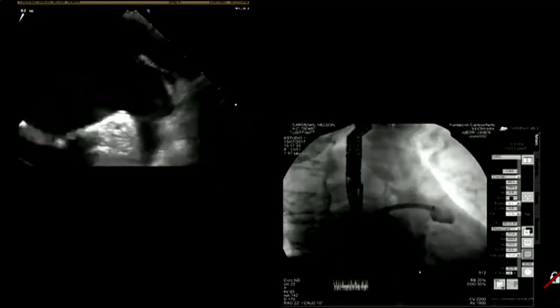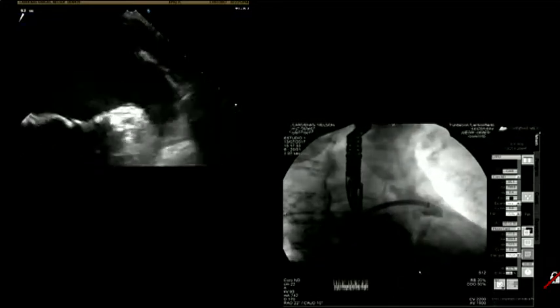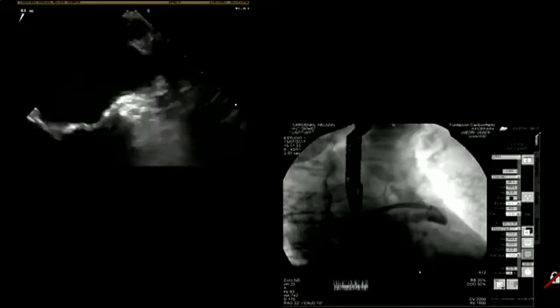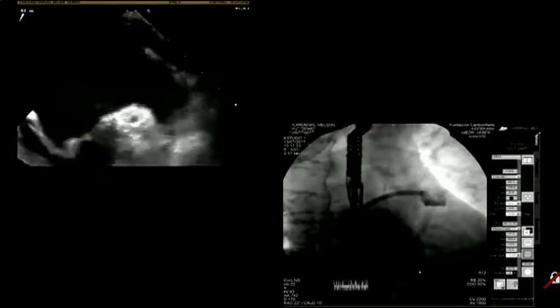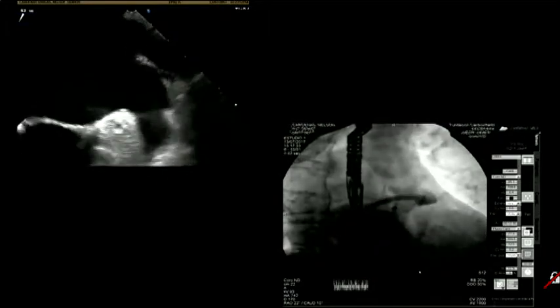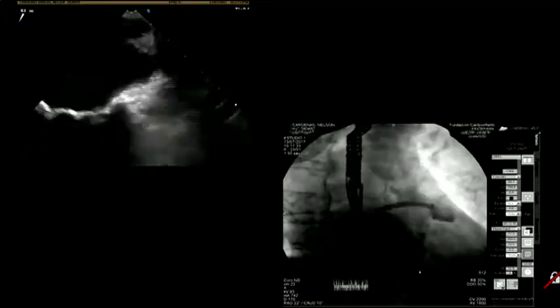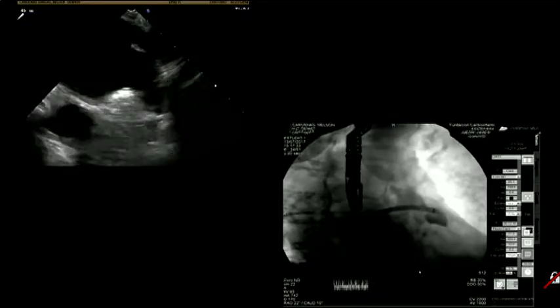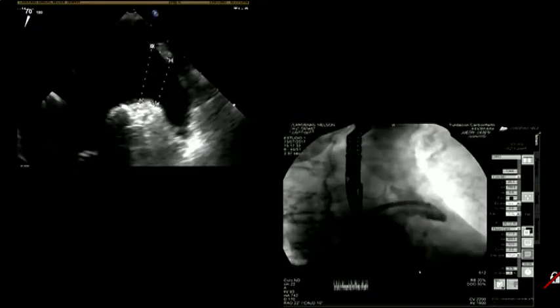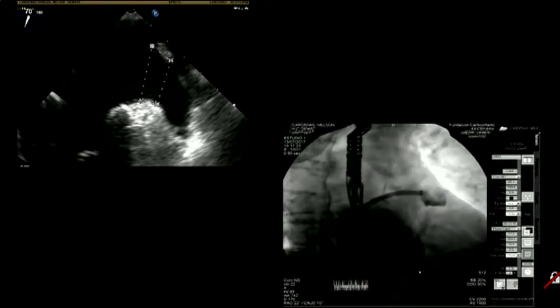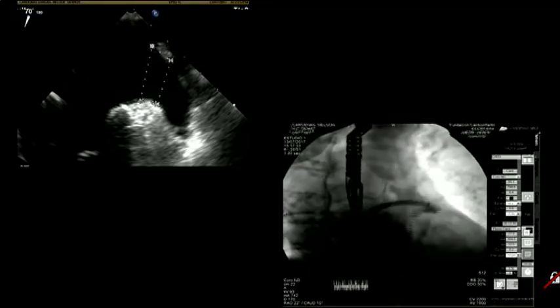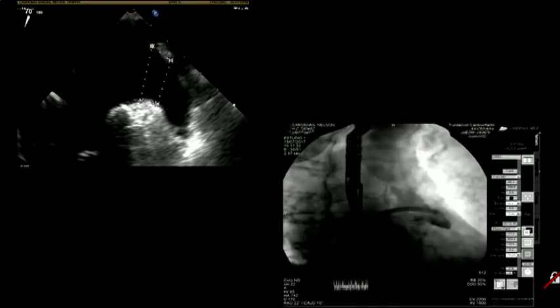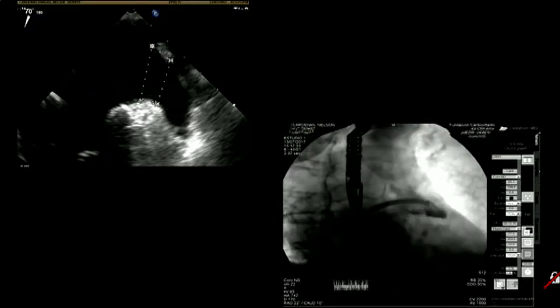The audience would like to see some pre-implantation echo images. In this echo view, you make the same measurement from the circumflex to the tip. For the Amulet, there are two measurements instead of one — because of the type of device, there is a distal zone and a proximal zone. The distal portion is the anchor zone and the proximal is the sealing zone.